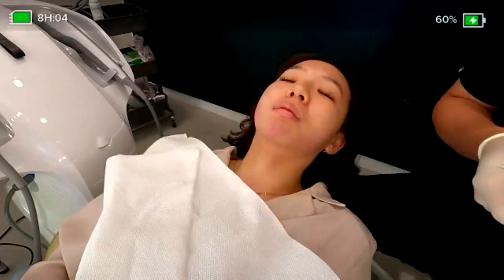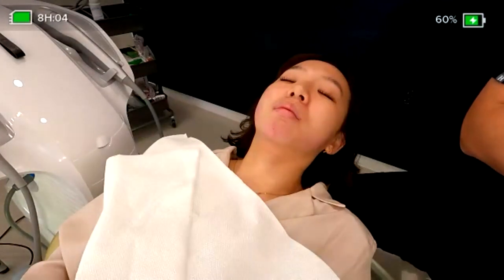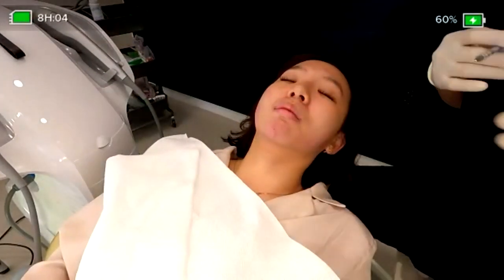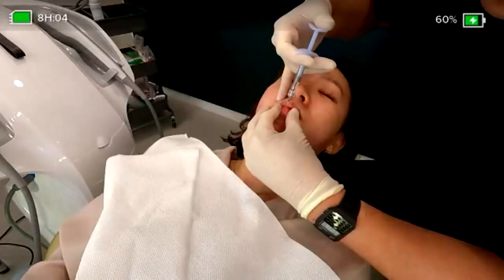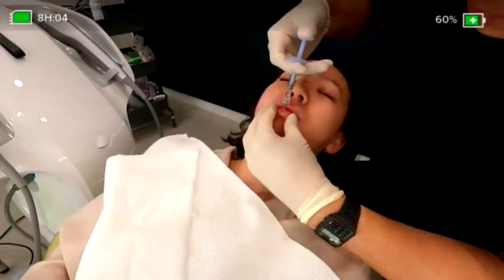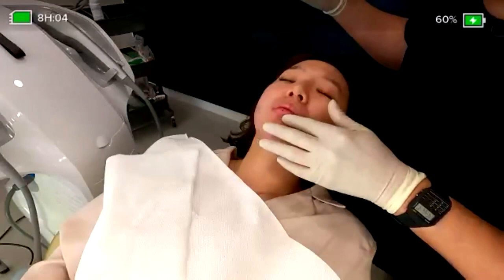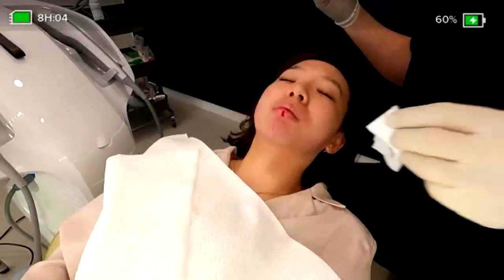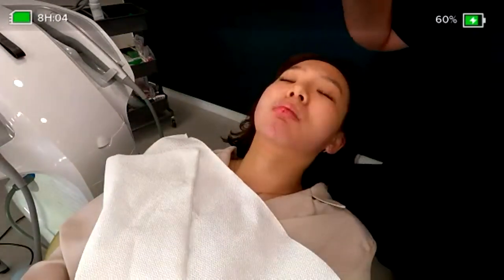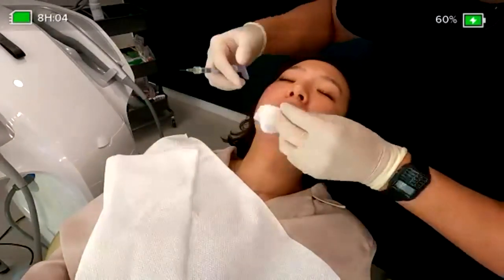So we are going to move a little bit faster. We are going here, more injection here, and then the needle injection inside, just a little bit from the inside. You can see the lip is now a little bit bruised, but we'll change the portion a little bit.